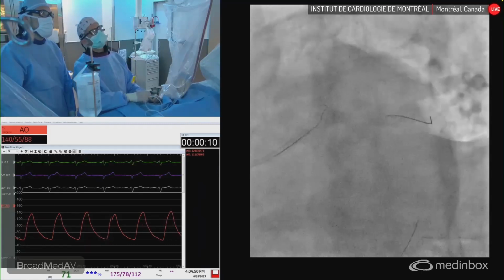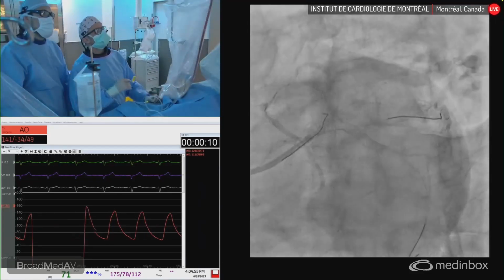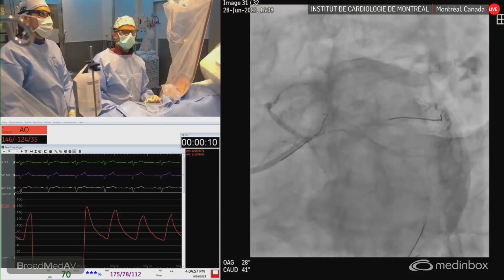Wait, it's prolapse. Like the wire is not free. Let's just see what's going on.